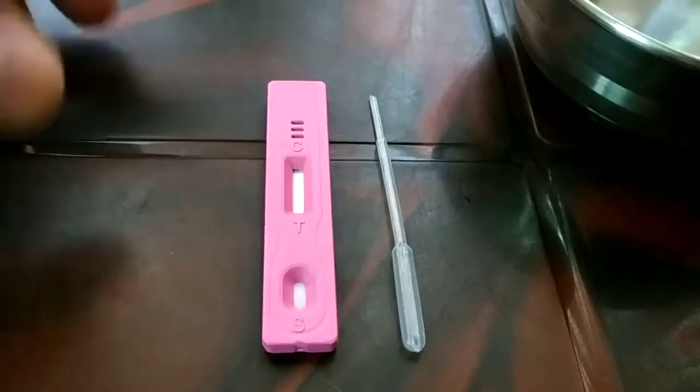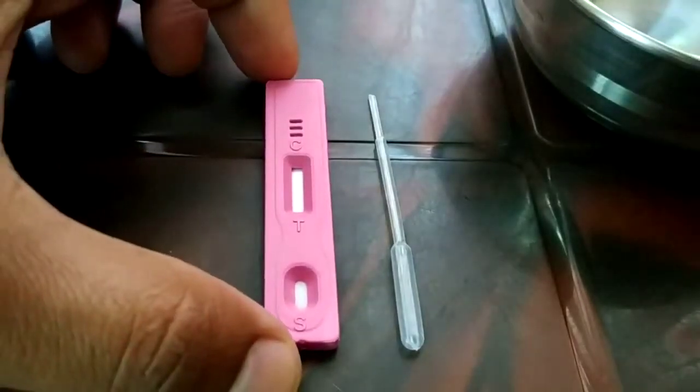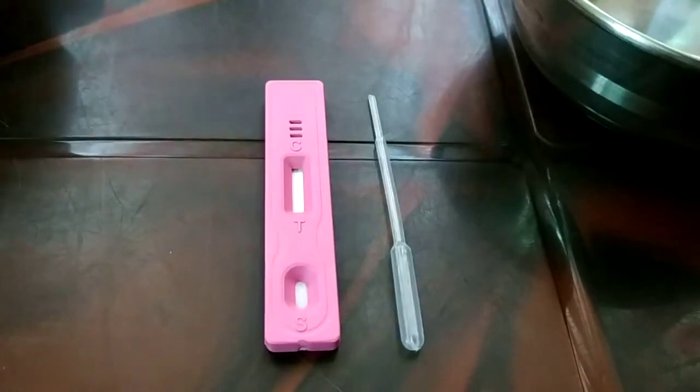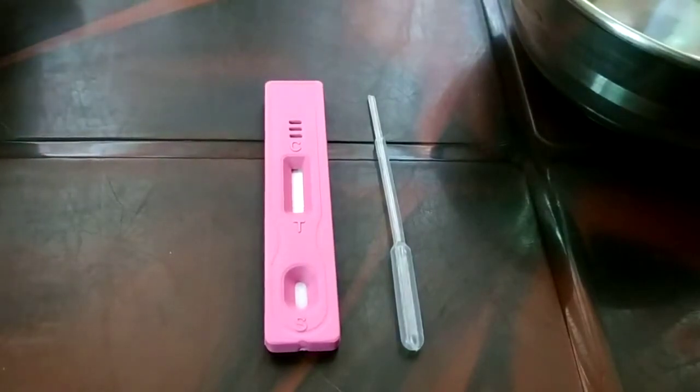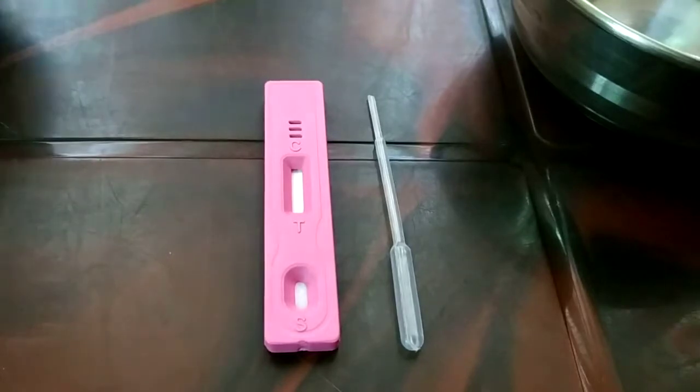Hello friends, I'm back again with another tutorial. In this tutorial I'll be guiding you step by step on how to do the early pregnancy detection test.